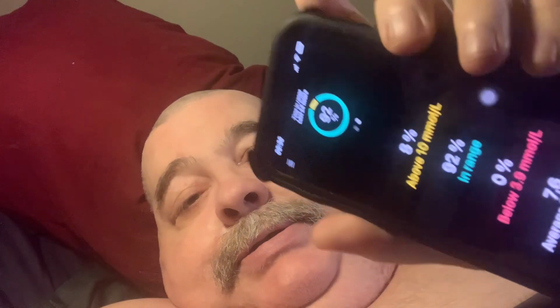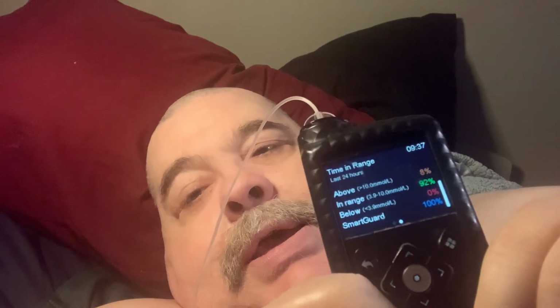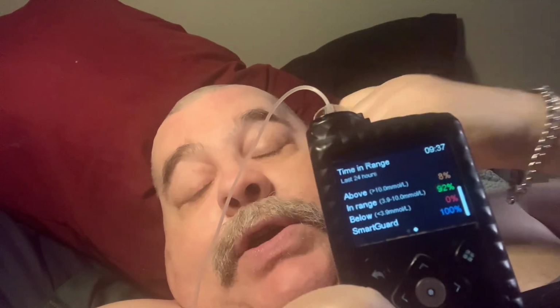What we're used to seeing on this channel, I should have had this ready, but I wasn't ready, is we usually see this is now condensed into this. So all of these graphs are great for you to help monitor how your diabetes is going.